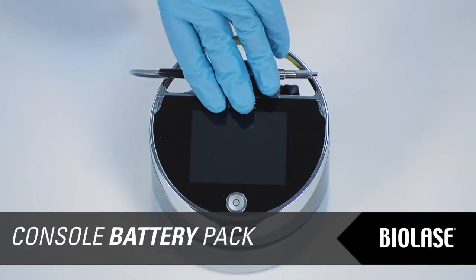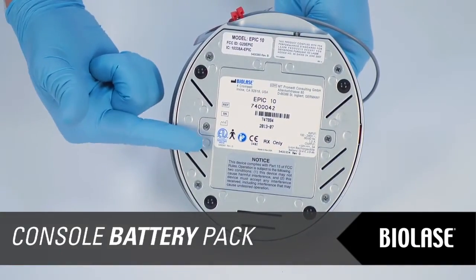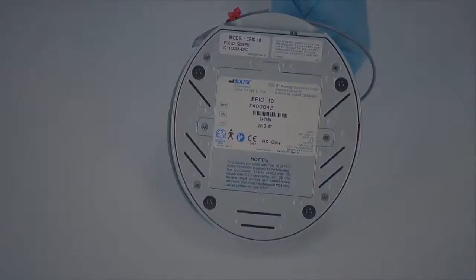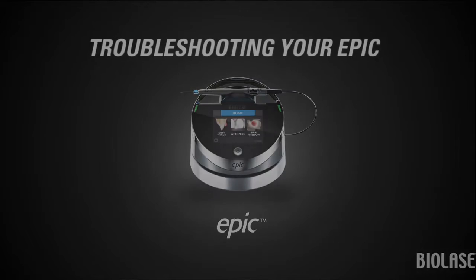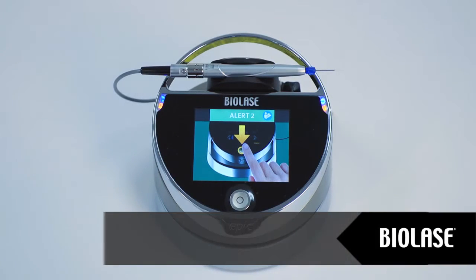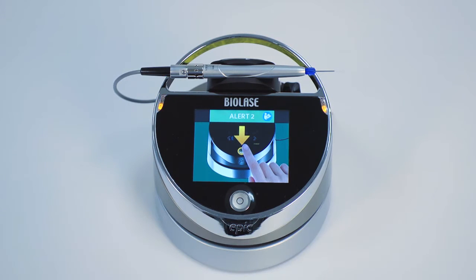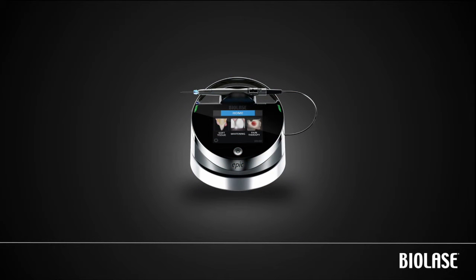To install or replace the Epic lithium-ion battery pack, please refer to the Epic user manual. Please use a Biolase supplied battery pack only. From time to time, your Epic system may display an alert, caution, or warning message on the touchscreen. For a complete list of possible messages and steps to resolve, please refer to the Epic user manual or quick setup guide. You are now ready to begin using your Epic.